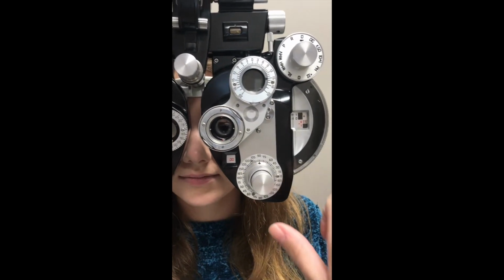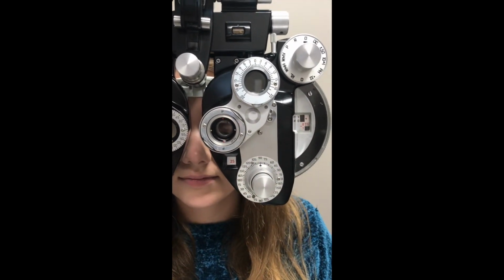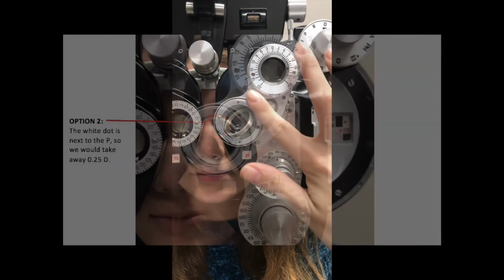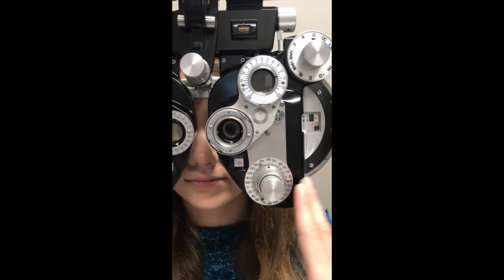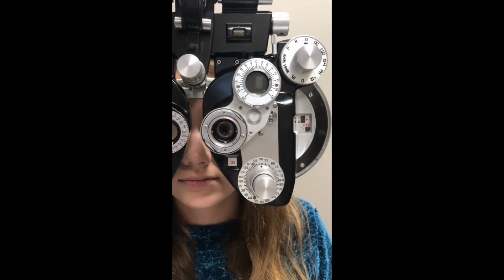First what we'll do is add in 0.25 cylinder for our patient here, and then, Abigail, option 1 or option 2? Option 1. Okay, so she picked red dot, and this means that our axis is in the right direction, and we can go ahead and go to axis refinement mode.